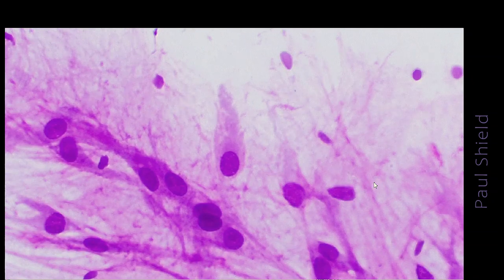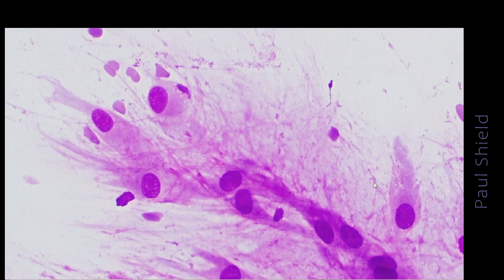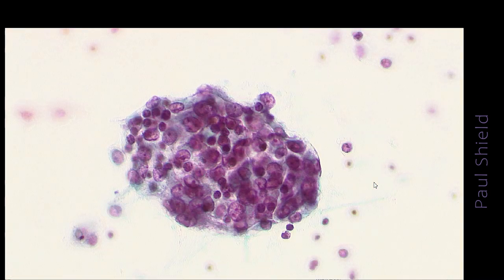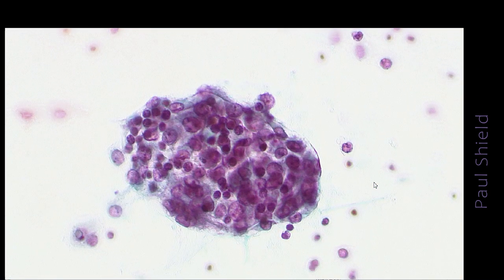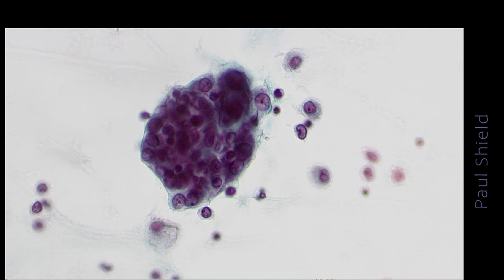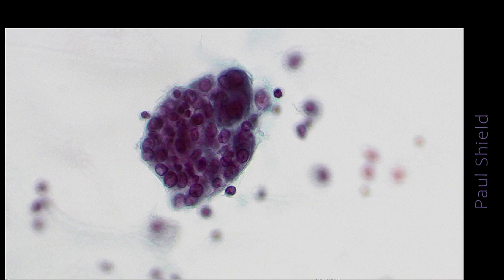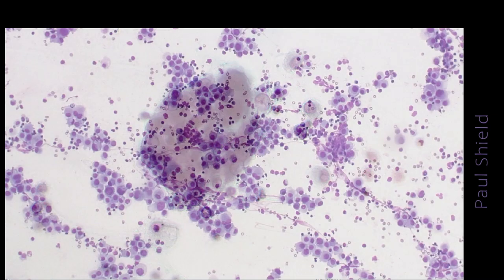You can see how fibrillar that mucin looks, and it's often a matter of searching around in these cases for some groups of epithelial cells that are not mesothelial. Here's one, and often these won't have a whole lot in the way of nuclear atypia, so notice these are pretty uniform. They've got pretty prominent nucleoli, but the key feature of this really is recognizing that background mucin that's present in the case.